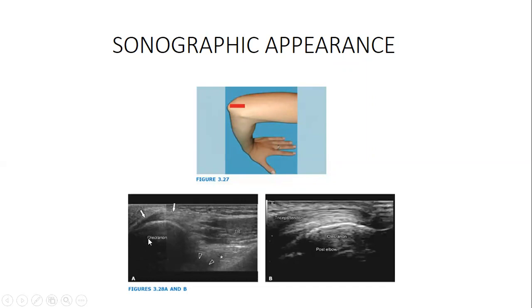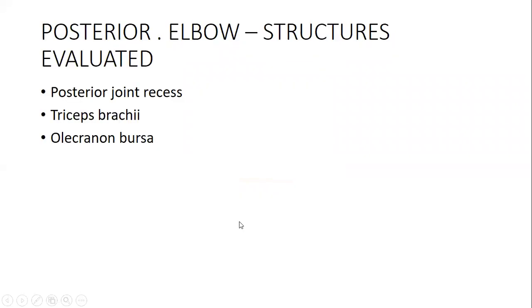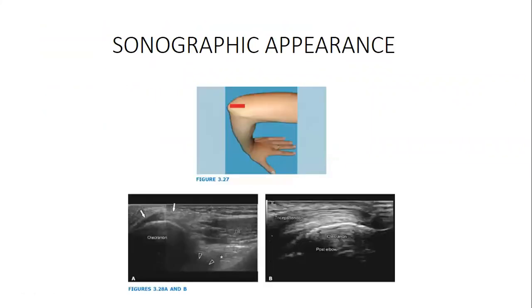So this is the olecranon, okay? And this is our triceps brachii. This is our triceps brachii, and this is the muscle which is there, and then it is attached to a tendon, and then it comes to insert all the way up to there. So this is how the normal posterior compartment will look.